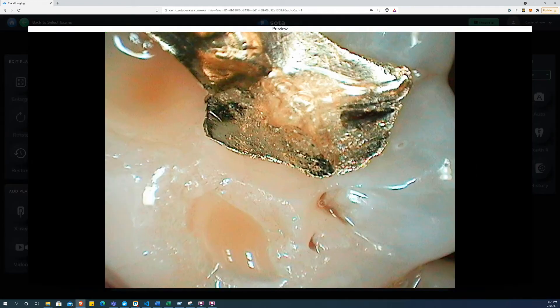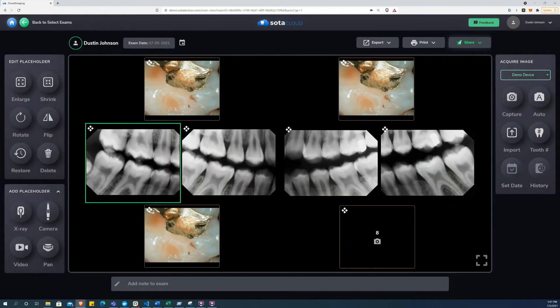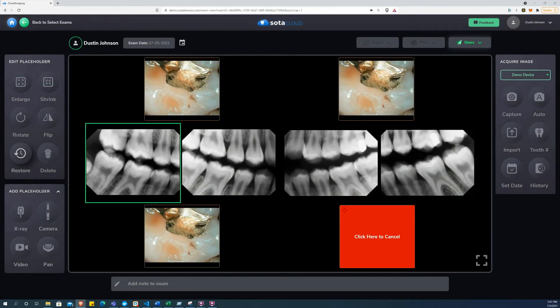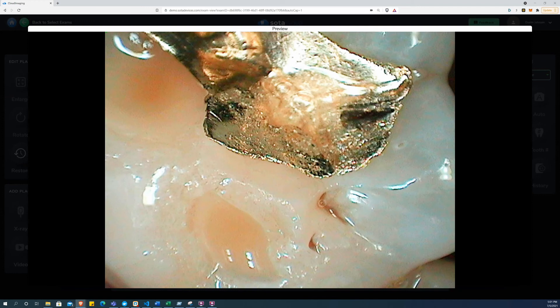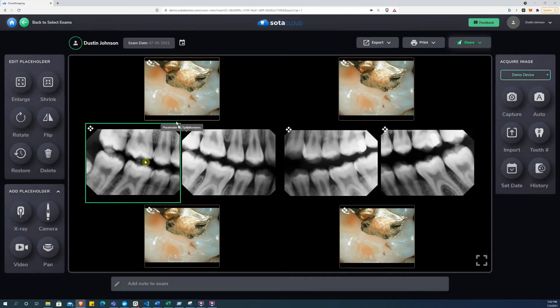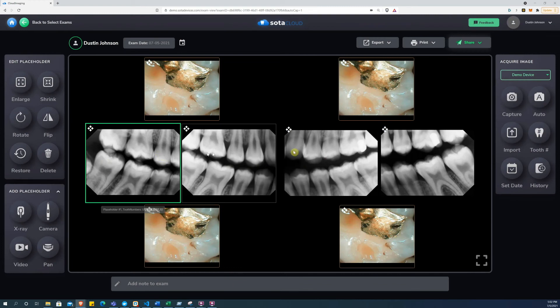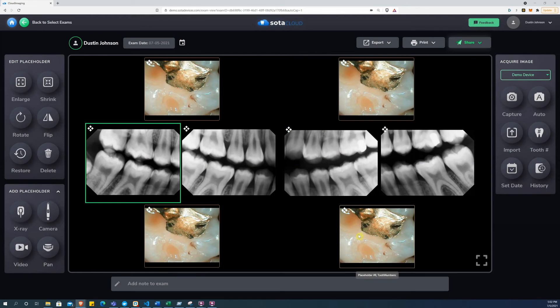Once you have completed the exam, you can still add images by clicking a button in the Add Placeholder menu. In this case, my exam contains 4 bitewings and 4 color photographs. But I can always add more at any time.